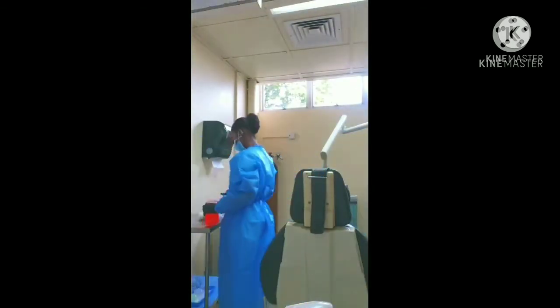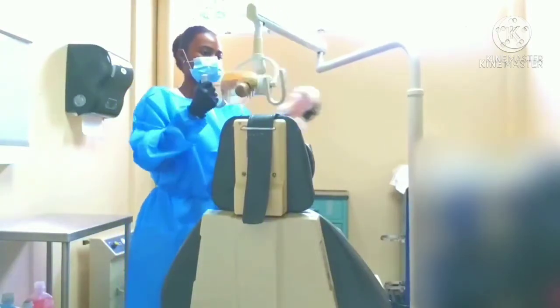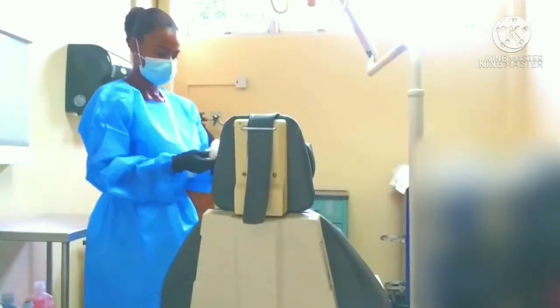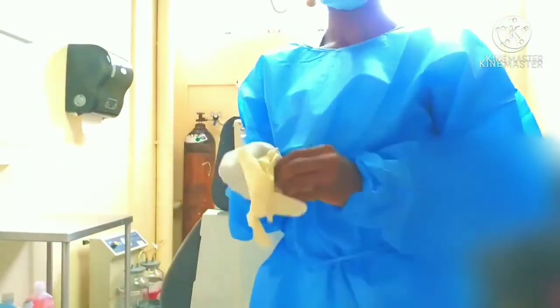That tank that I'm pointing at there is a nitrogen tank that we use for surgical extraction, and I'll show you in another video how I attach it to the tank and how it is used. So I'm wiping the surfaces, and this is done after each patient, but the first thing that we do in the morning is to wipe down every operatory, every chair, every light. So I go to the surface first and then the light, and then I wipe the chair. I have to get every part of the chair because people have to sit in the chair for a good amount of time depending on the procedure.